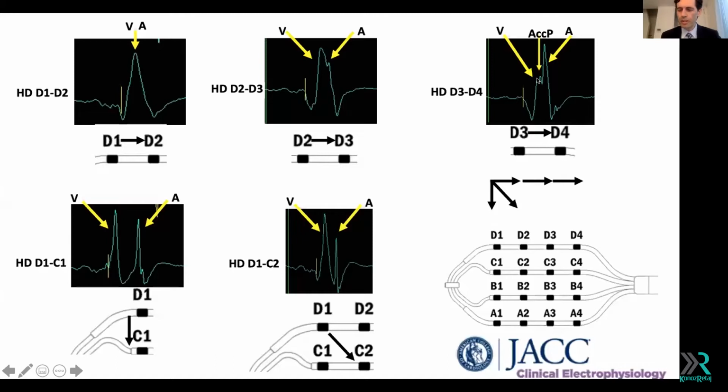At that point, we speak with our technician and tell them to tag this point: please tag D3, D4 in the electroanatomical mapping. Afterwards, we only have to go there with our ablation catheter and make the application, and you will eliminate the accessory pathway with a single shot. You can also identify that the trajectory of the accessory pathway is not in another direction.